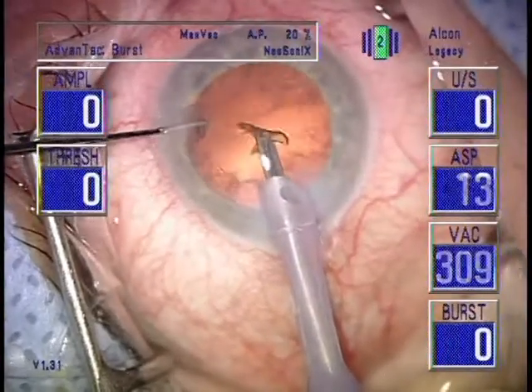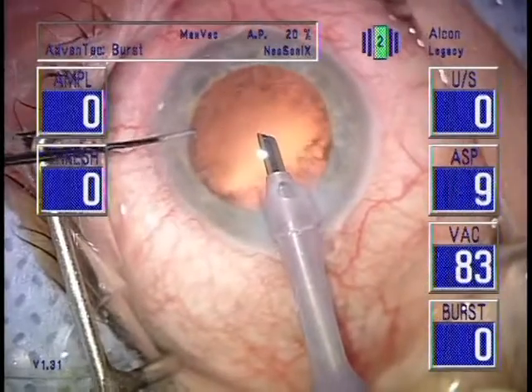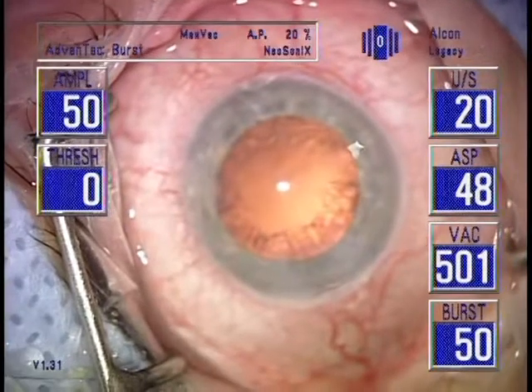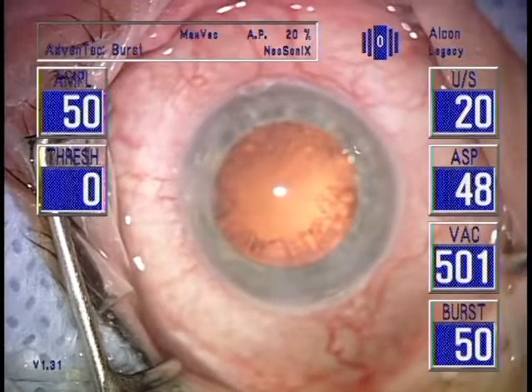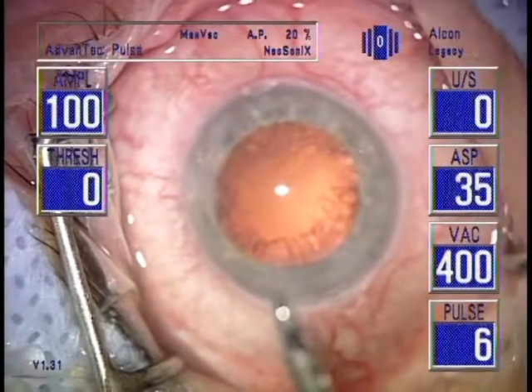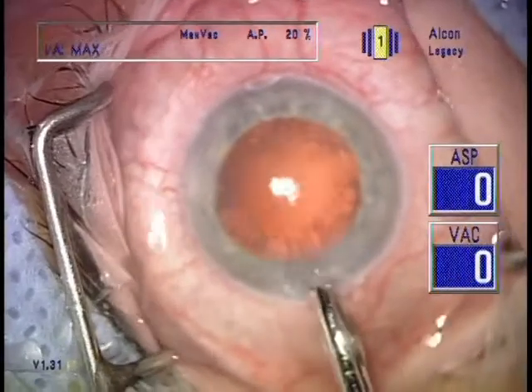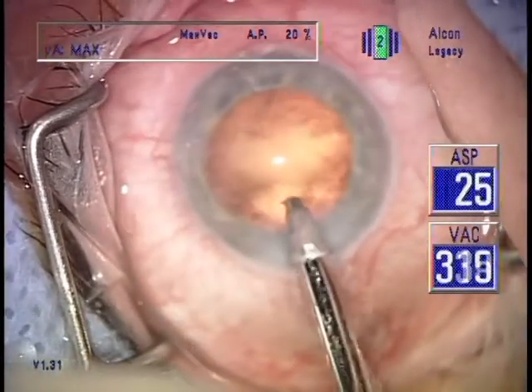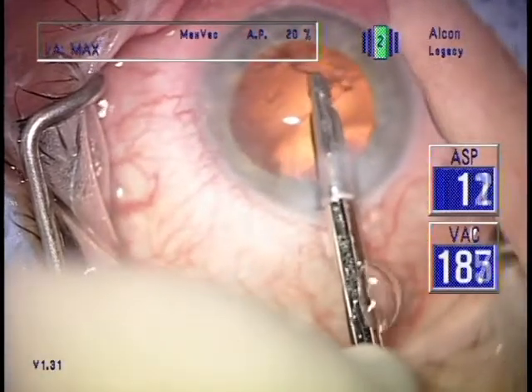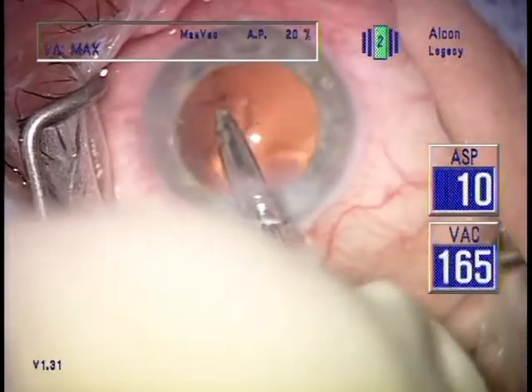The best time to cut the endonucleus is at the beginning of the case, because of what I call the grapefruit principle. Have you ever noticed when slicing a grapefruit in half how easy it is to cut the seeds? However, when a wet seed is on the countertop, it is almost impossible to slice the seed. This is explained by the fact that the pulp cells of the grapefruit caress the seed like a vice. With cataract surgery, the endonucleus is like the hard seed, and the cortex is like the pulp cells of a grapefruit.